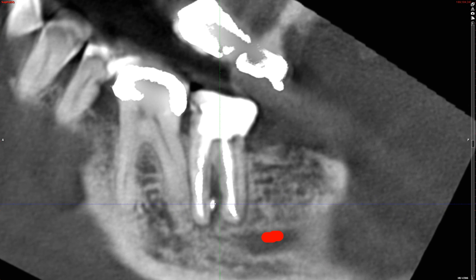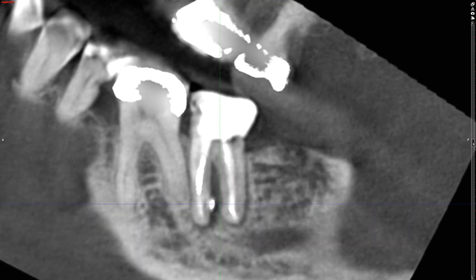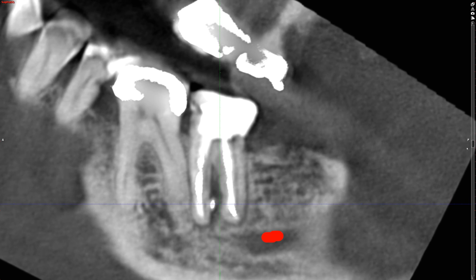Now in the sagittal section, we again see that separated or extruded endodontic filling material — unable to exactly trace how and where it came from the main canal. But from this view it should be pretty clear that this is located outside of the root surface. Another interesting thing is there is a thin layer of radiopacity with a density of dentin surrounding this radiopacity.